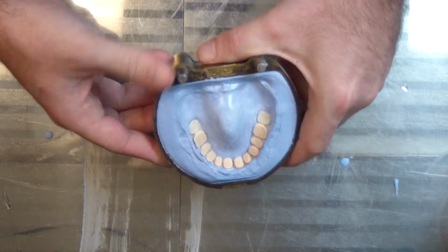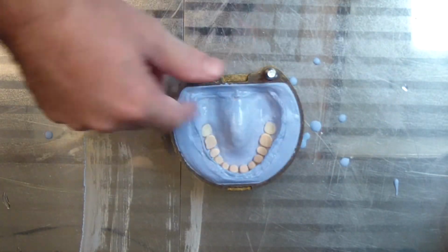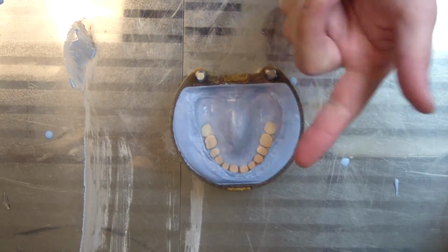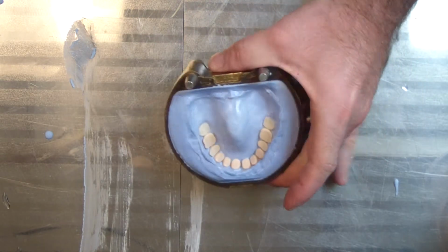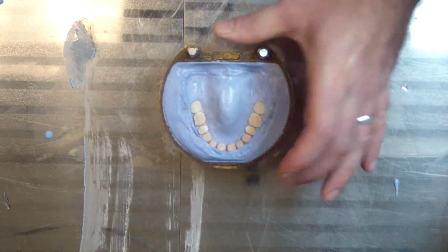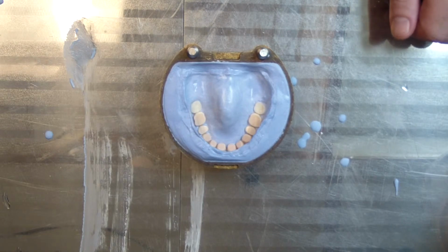Okay, so the upper from the same case has already been flasked and boiled out, and I've already placed separator on it. As you can see, if you follow all those steps, the replication is pretty exact. I don't think you can tell from this, but I took some macro images and I put them on Facebook.